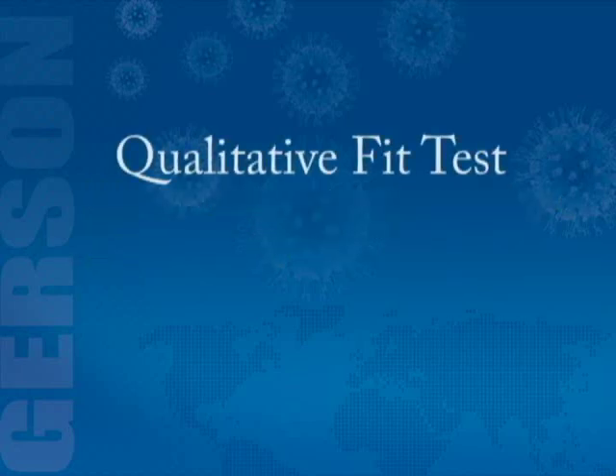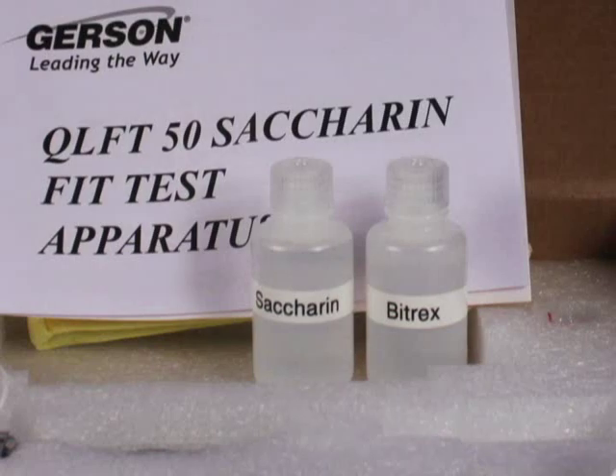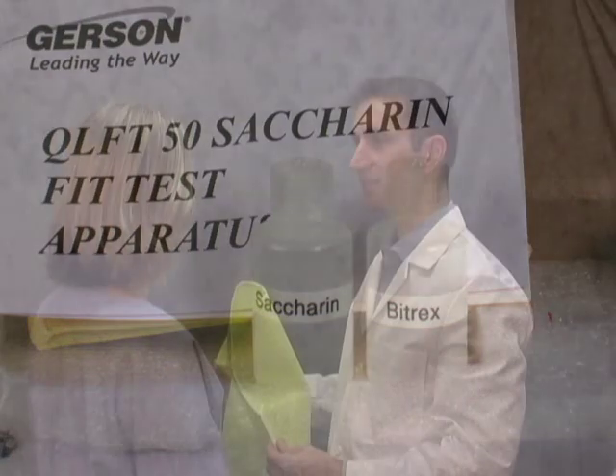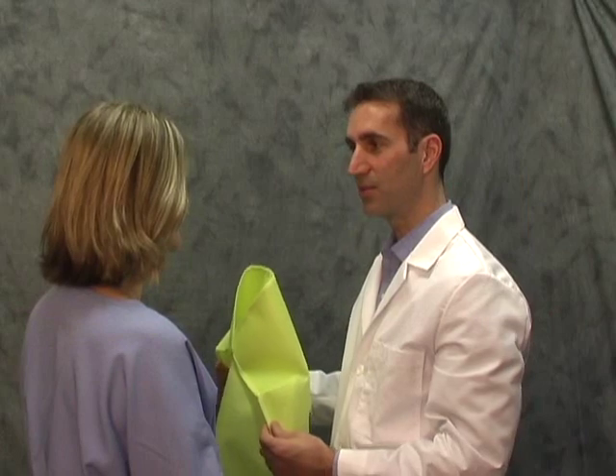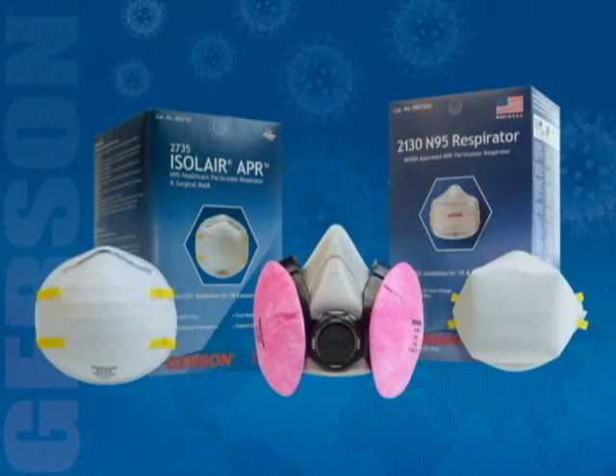One type of qualitative fit test can be performed with a mist that contains either saccharin, which is a sweetener, or a bitter tasting substance known as Bittrex. The test process is the same for both test agents. Your instructor will tell you which material will be used for your fit test. This test is valid for any particulate respirator or any gas and vapor respirator with particulate filters.